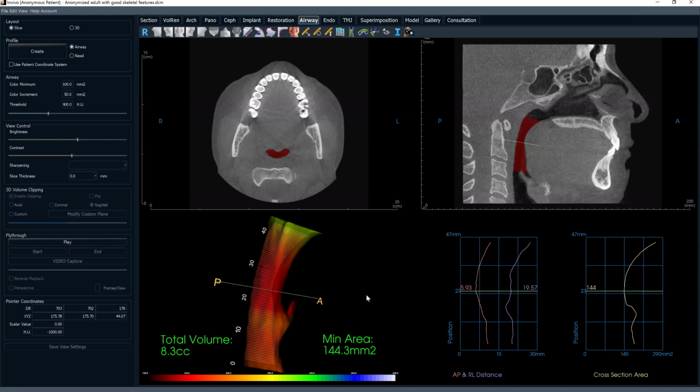We'll do a couple other questions here, Dr. Adair. So it looks like our next question says, for airway, patient sleeps lying down. How does standing capture come into play? It doesn't. And that's the reality. And that's one of the areas of contention within airway analysis. This is not diagnostic. It just gives us some more information, and that's a very good point.